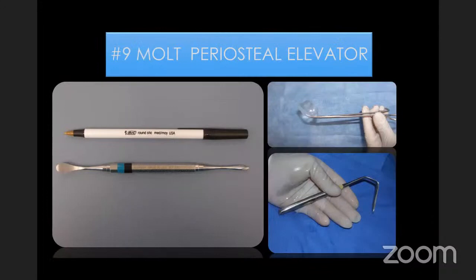And in terms of instrumentation, these are three very simple instruments that are helpful. Number one is a periosteal elevator, called a number 9 periosteal elevator. The upper right is a long, thin tonsil clamp. And in the lower right is an Aufricht nasal retractor, which is a very useful instrument to retract the cheeks.